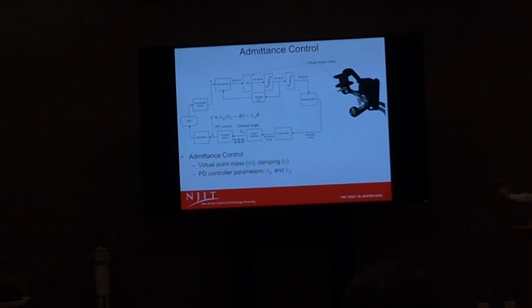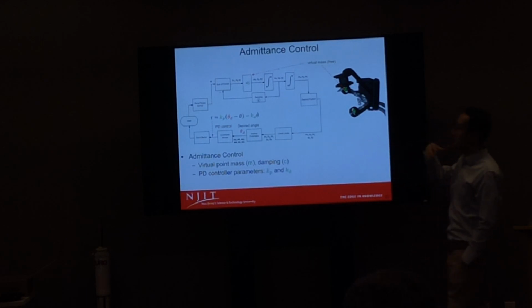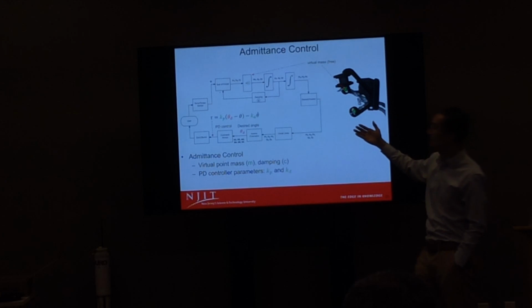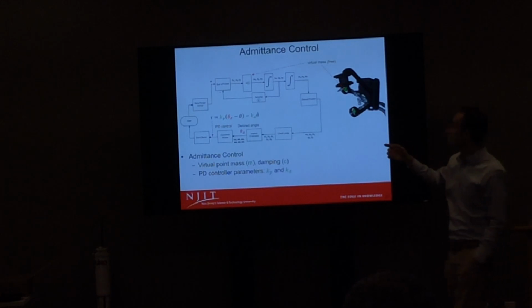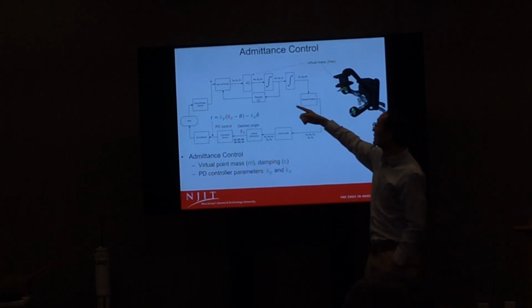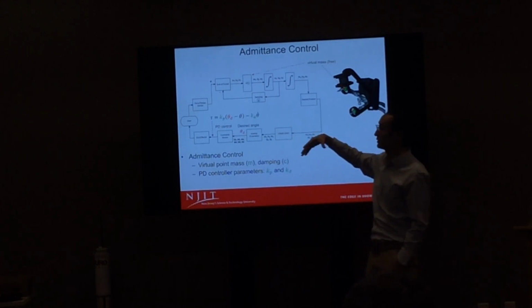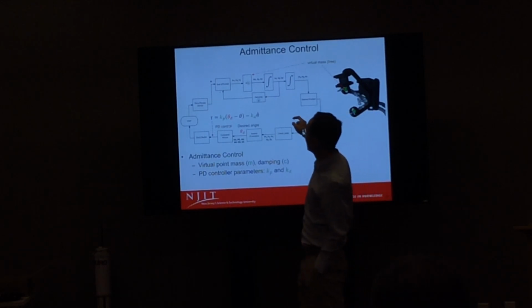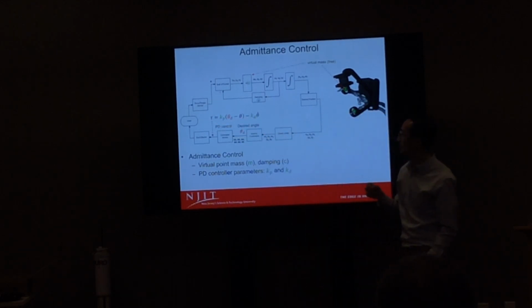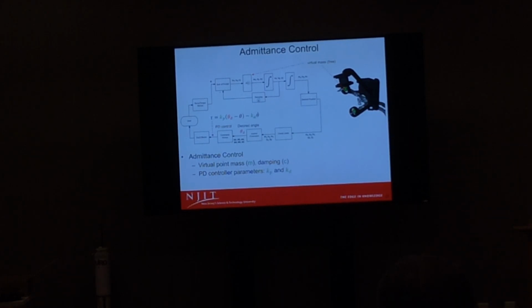So now, okay, let's do a control. We do have an admittance control which was implemented in the hardware, so I implemented something in the software and tried to tune some parameters. The admittance control is pretty easy. I think you control people probably know it pretty well. The key point I want to say is a virtual mass here. It's driven by this force sensor, and moves up and down, and then we use inverse kinematics to calculate your target joint angle. So there's this kind of loop here. What we need to do is tune up some of the mass parameter and damping parameter. There's a few things we want to tune up.